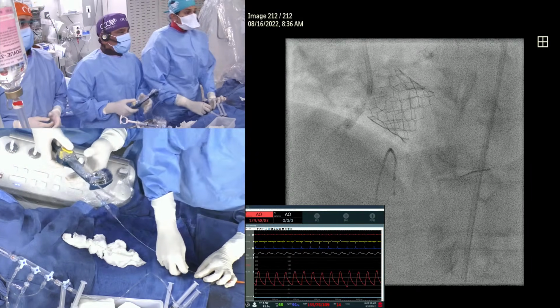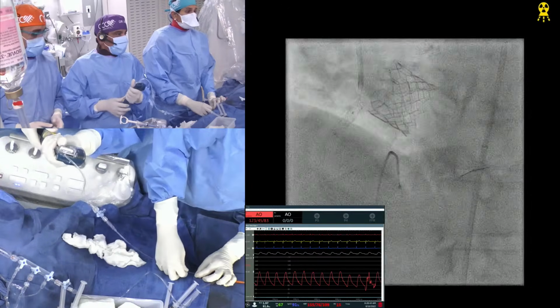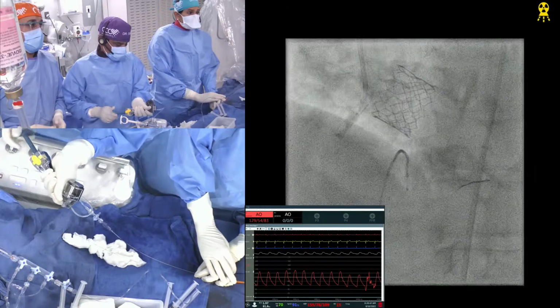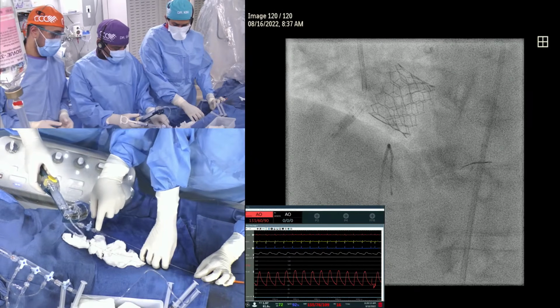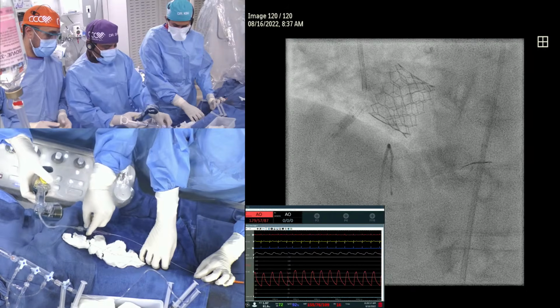Okay, let's do it again. Go up here, in between. This is the overlap area. Have the OCT ready, and I think, oh, bigger bubble, bigger bubble. Make sure this is tight. Cannot have it loose. That's why the air keeps coming. Good. And we do the ostium now.